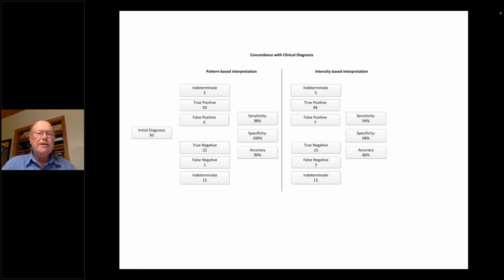And the indication was in patients who either couldn't have an MRI, couldn't have enhancement, had an inadequate study, inconclusive results, or the MRI interpretation was discordant with the clinical expectations. As on the original study, if you use quantification with SUV max, the sensitivity and specificity are significantly lower.